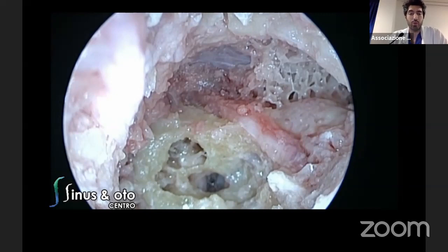Of course, what you pointed out is that sometimes we have to remove elements inside of the middle ear, which are the ossicular chain, or we can proceed to other steps only if we can remove things. For example, what happened when you move narrow structures? Can the flow inside of this small vessel be elucidated? What can we see inside of the middle ear when we go through an endoscope?